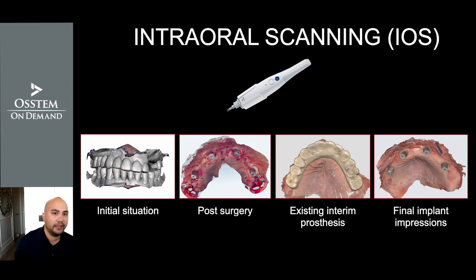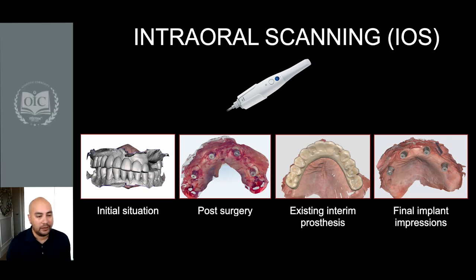How about the introduction of intraoral scanning for full arch implant restoration? How reliable is it in the different steps for achieving the final restoration? We know that it's a predictable tool to utilize at the initial situation, when we want to scan the dentition before surgery.